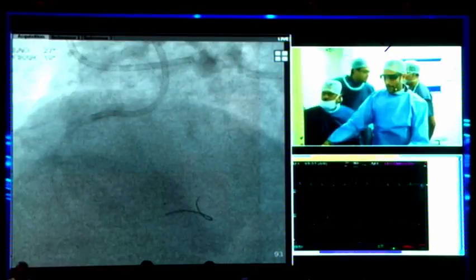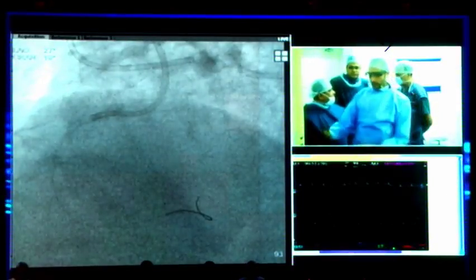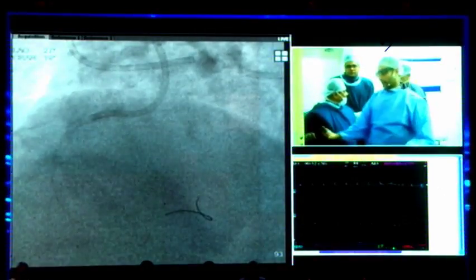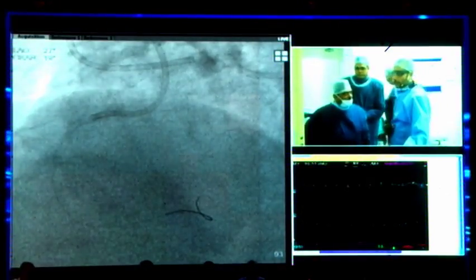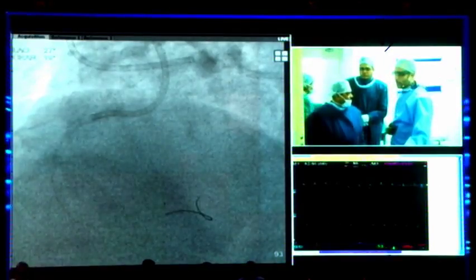Now they gave you the balloon? We're waiting for the balloon. So the system is that the inventory is in a storeroom, so someone's got to actually go and get it every time we get something. Some of the things we have brought up front, and some things, if you ask for something new, they've got to go get it. It's all good.